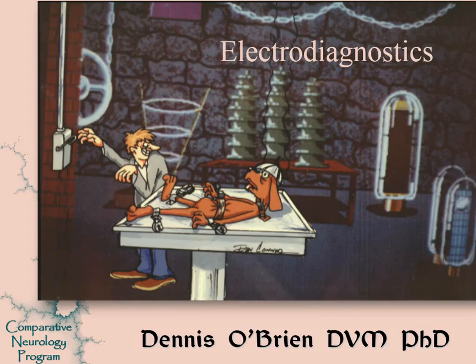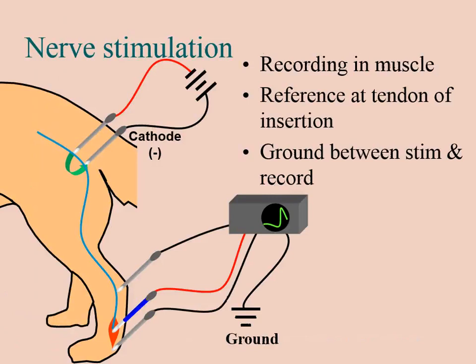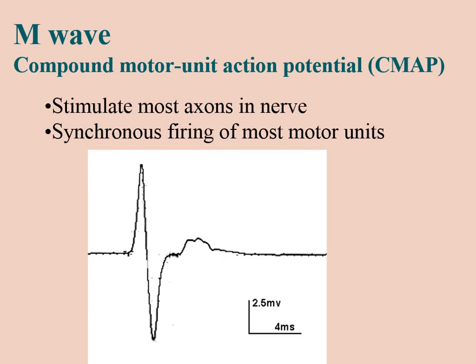So, we're going to talk more about electrodiagnostics today. Last time we started messing with the nervous system rather than just listening to it. And so we talked about stimulating a peripheral nerve and recording the evoked response from a muscle. If we stimulate a peripheral nerve, we're going to fire all of the motor units within that nerve. And we're going to then evoke what's called an M wave or compound motor unit action potential.